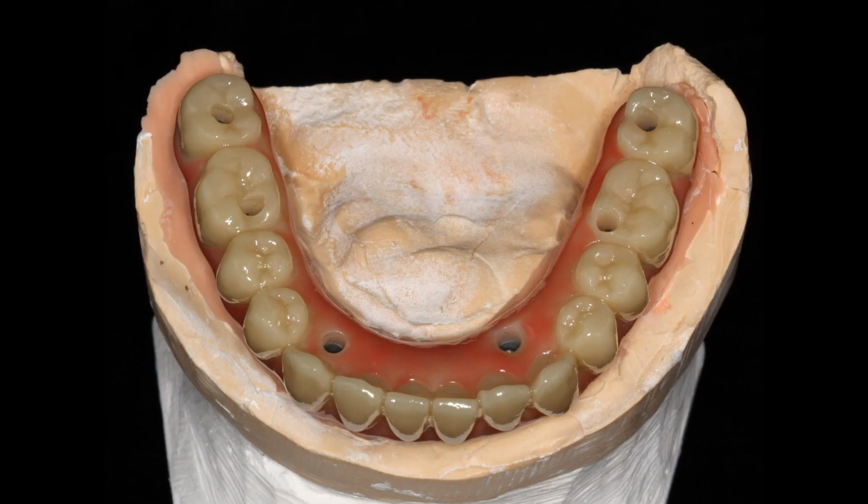Here is the lower prosthesis. It has a titanium skeleton and it is wrapped in monolithic acrylic, meaning that the pink and the white are the same piece of acrylic. In the past, we used to process these like we did dentures, where the teeth were one acrylic and the pink denture foundation was another. So what we've gone to for strength is monolithic acrylic, meaning it's all the same piece and is much, much stronger.